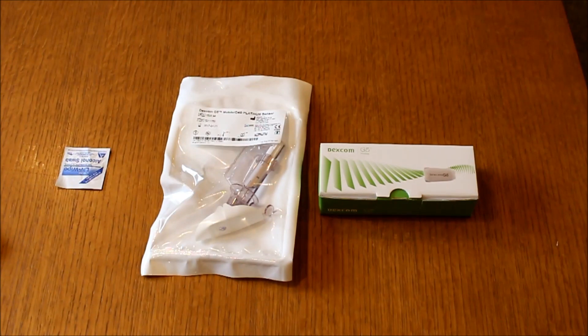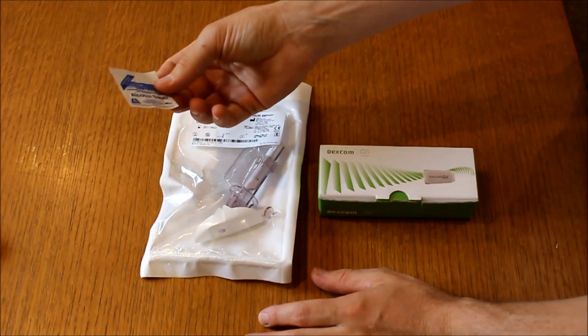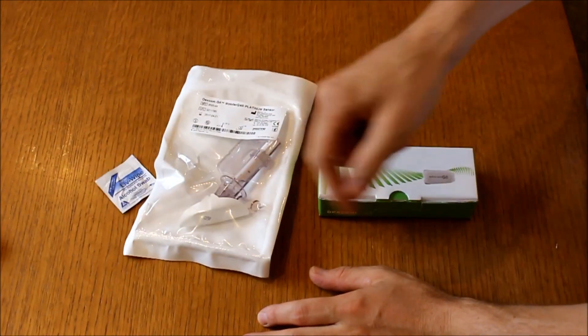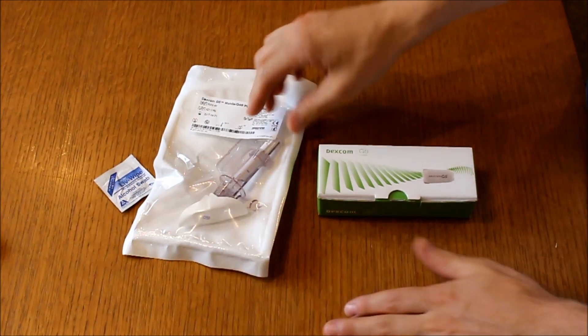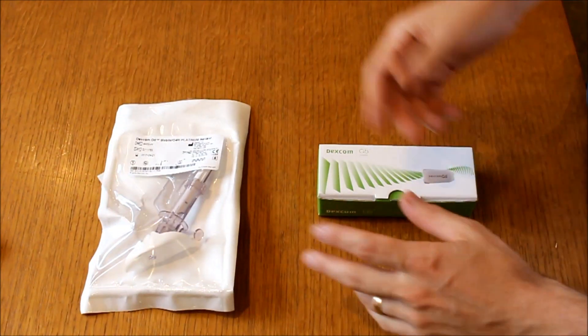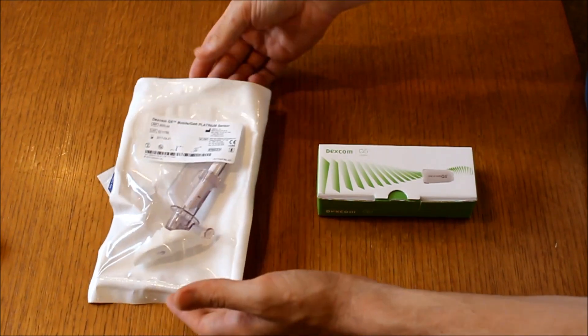The next thing we're going to do is prep the skin with an alcohol wipe and let it dry. So let's take a closer look at all the little bits and pieces that we need. We need an alcohol wipe to make sure the skin's nice and clean and there's no oil there, so the sensor adhesive sticks properly and you get the most time out of it. The last thing you want is for this to fall off after three days — it turns out to be a very costly exercise if that happens.